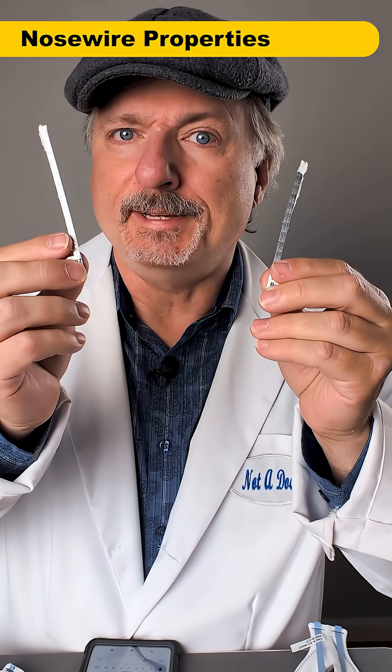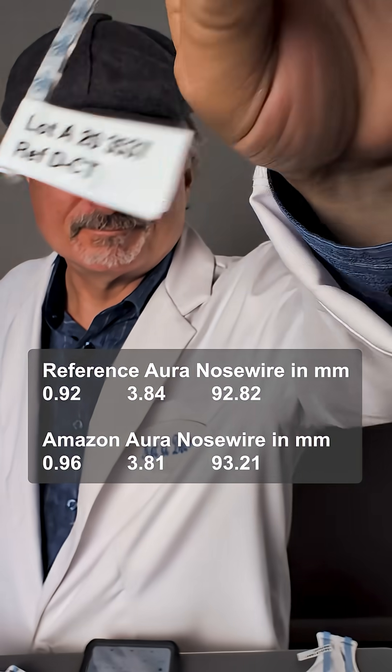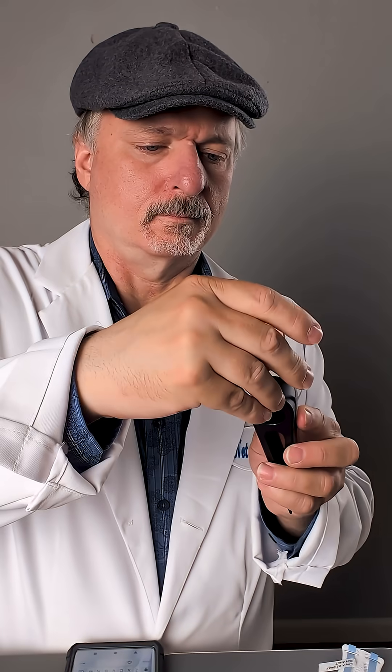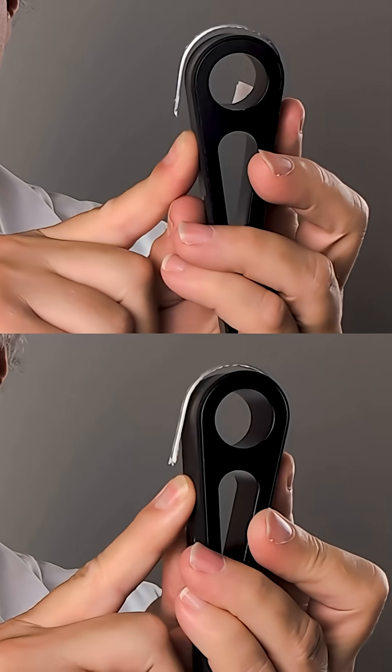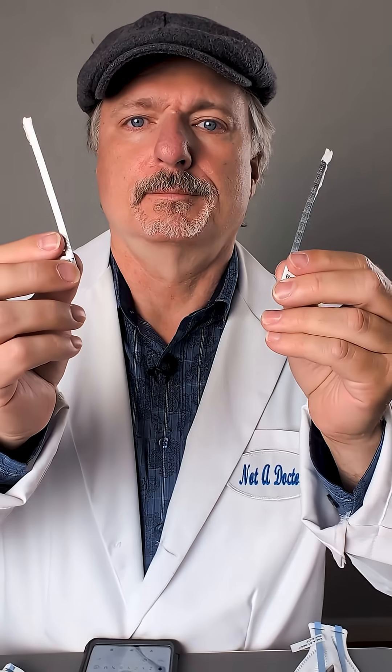Now let's see if they compare well to other Auras. The nose wires look identical, but let's find out for sure. The dimensions are the same between my reference Auras and this batch. Same goes for the amount of spring back and even the stiffness. So the nose wires are a pass.